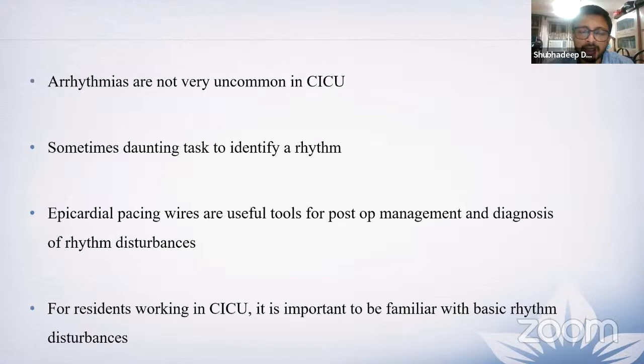In my last slide, I'm just going to reiterate that these arrhythmias are not at all uncommon in the cardiac ICU. And sometimes it may be really daunting for us to identify a rhythm. As I said, A wires or epicardial pacing wires can be really useful, not only for pacing the heart, but also in diagnosing a rhythm. And for residents working in ICU, it's very important to be familiar with some of the very, very basic rhythm disturbances. Thank you.